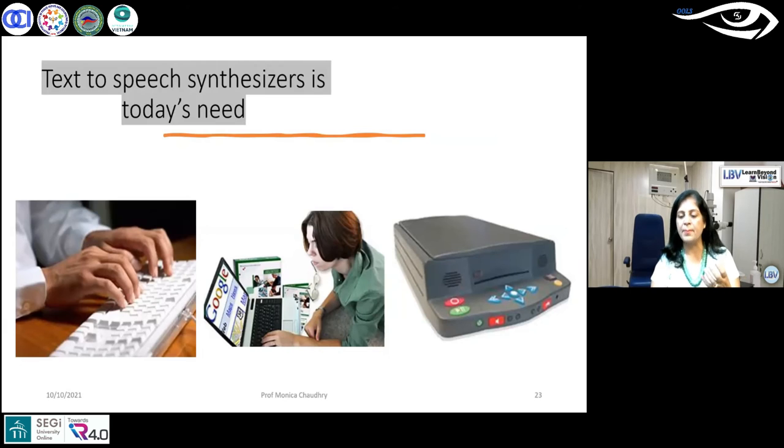Now, a visually impaired person is going to utilize this text-to-speech and speech-to-text concept, and everything changes in his life. There are so many free apps, software, applications, inbuilt applications to even your Microsoft, Google Chrome's, everything, you know, where your visually impaired need to be helped. All you need to do is, you are not here to teach them this. Text to speech, speech to text, there are rehabilitation centers which are now training, but you need to divert.